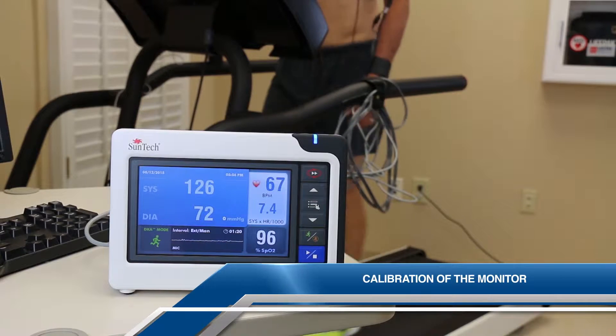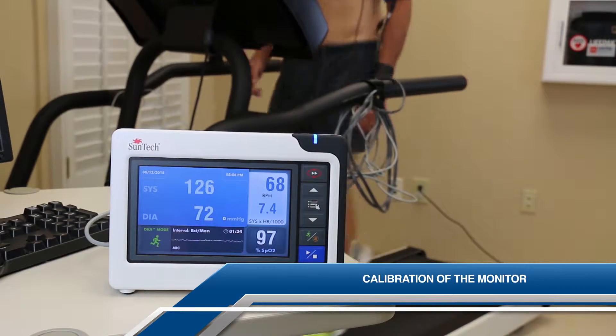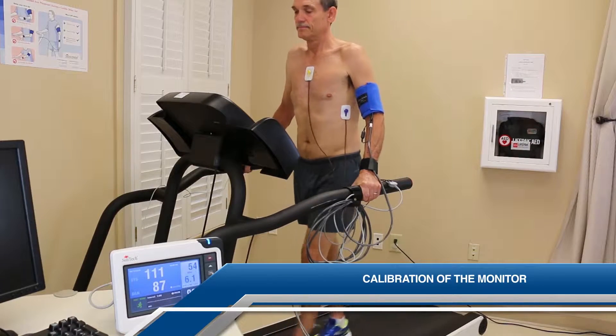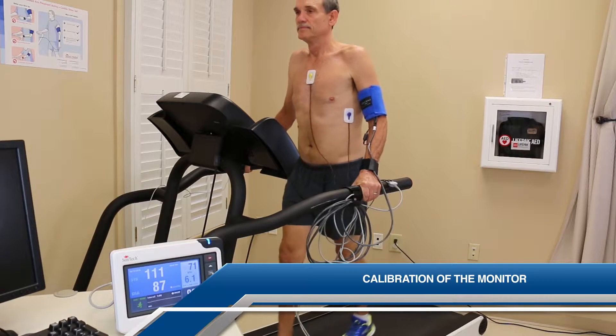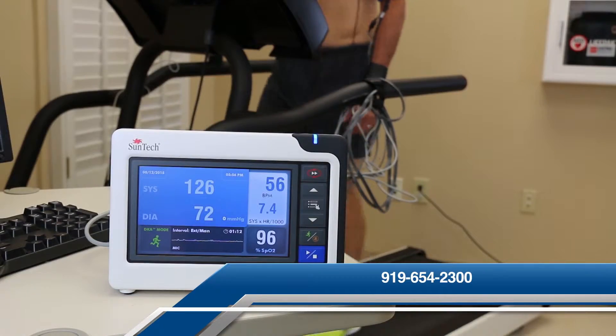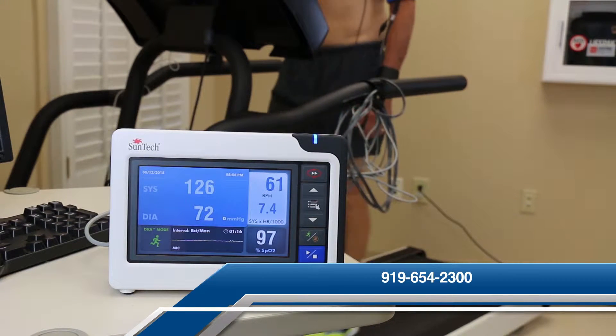Please note that the Tango M2 is an R-Wave gated device. You will not be able to check the accuracy with a commercial BP simulator. Also, you cannot use an ECG simulator with the stress system and then place the cuff on a staff member's arm. There is a protocol for correctly checking the accuracy of the Tango M2. For further information, please call Suntec customer service at 919-654-2300.